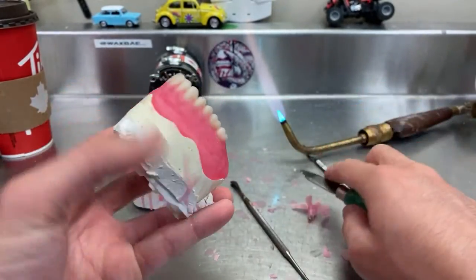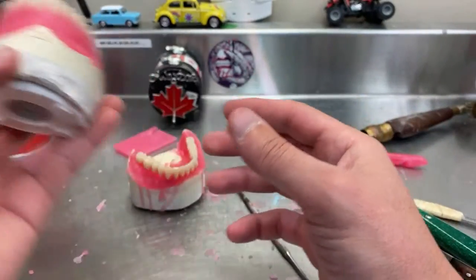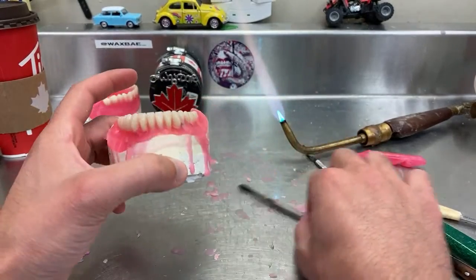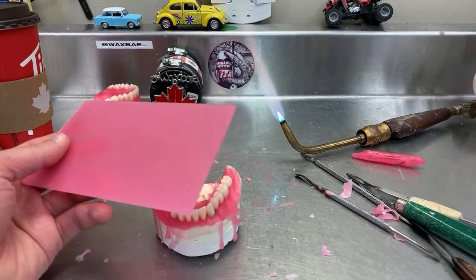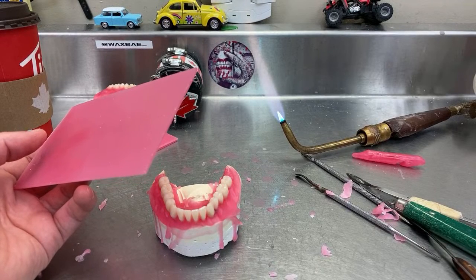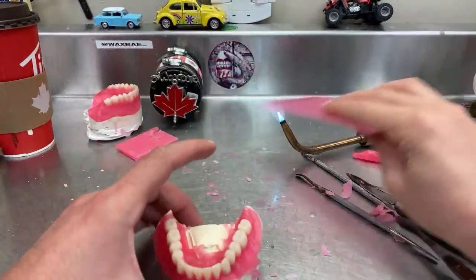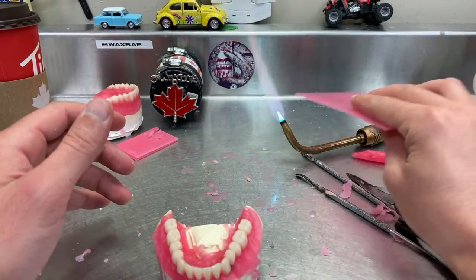So right now I wouldn't touch it as in carving or anything because the wax is still warm. So I'm just going to leave it till it cools down while we're working on the lower quickly. I'm not going to be festooning the lower, just a quick wax up on that one so you don't get bored. And is that the quality of wax you play with for waxing and festooning? Yes. I'm gonna do it right now.